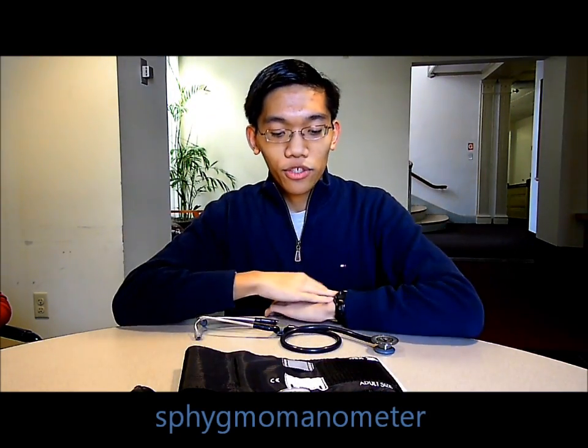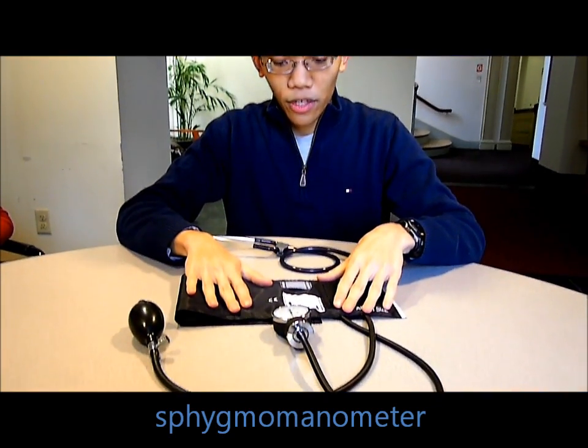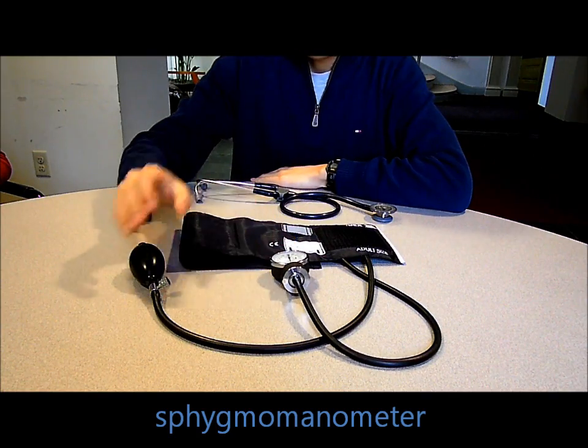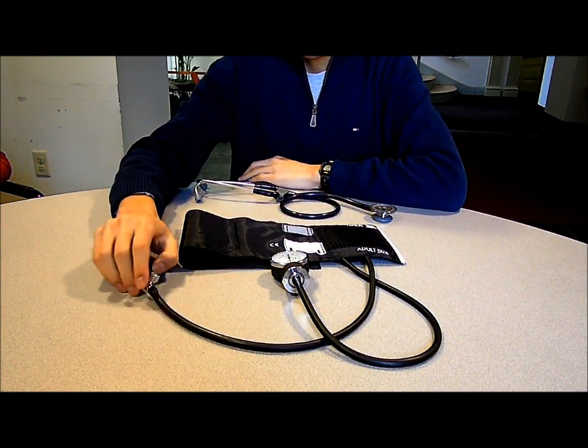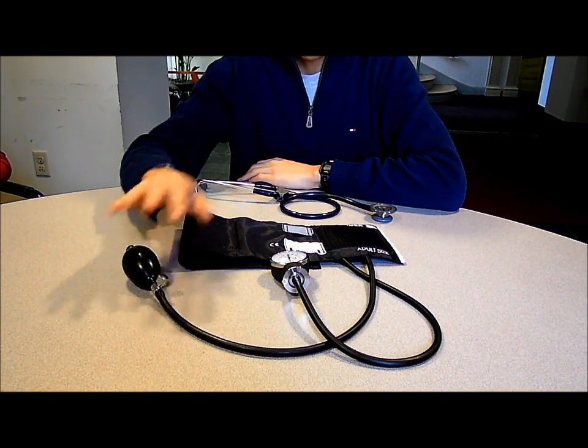So this is the blood pressure cuff, or sphygmomanometer. The cuff is here, including the inflation bladder inside. This is the pressure gauge with the reading on it. And this is the inflation bulb, which you use to inflate the cuff, and the valve, which you twist to control the airflow to and from the inflation bladder inside the cuff.